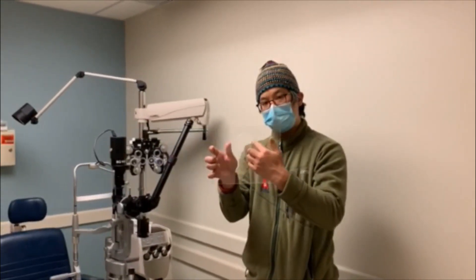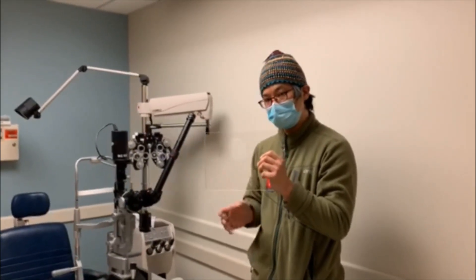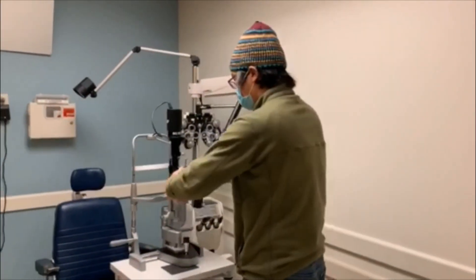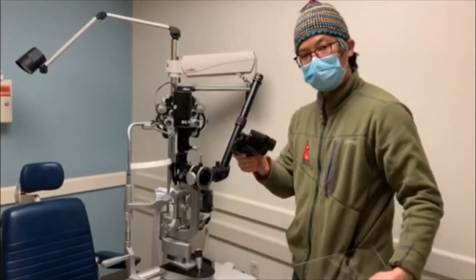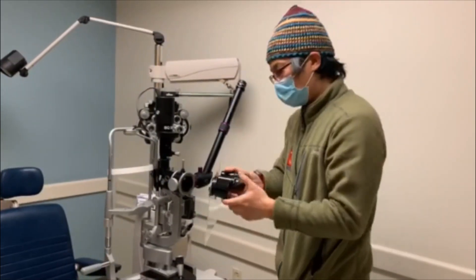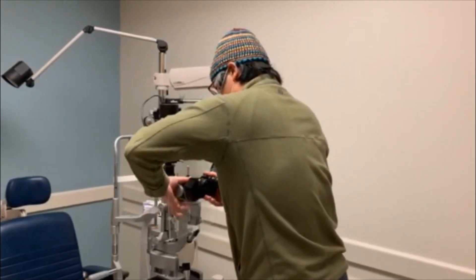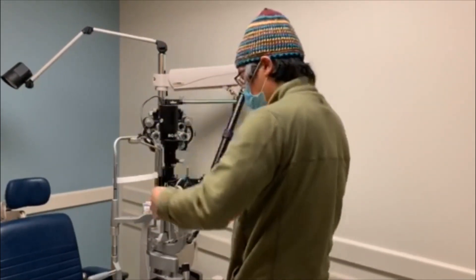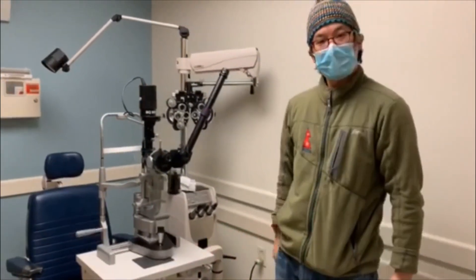Here we have our pre-cut shield with the three inch opening, and it's going to fit perfectly on this BQ900 slit lamp. I'm going to turn this to unlock the oculars — the ocular slips off, I put the ocular through the opening, put it back on, tighten it, and now we have a large slit lamp protector.